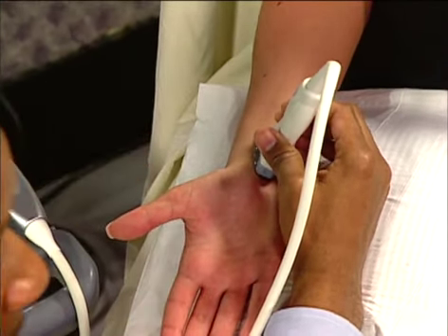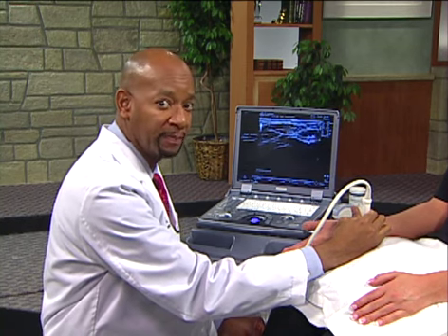Let's next obtain the transverse image of the volar aspect of the wrist. This is a critical site to examine because it may be the site of a number of different clinical scenarios, whether patients have carpal tunnel syndrome, osteoarthritis, or inflammatory type changes. Let me first demonstrate how to easily identify the median nerve. Remember that the left side of the screen will be the medial aspect of the body, and the right side will be lateral. Place the transducer just proximal to the crease of the wrist, then go lateral until you pick up the signal from the radial artery. You can take advantage of the Doppler to show a nice pulsatile image coming from the radial artery.